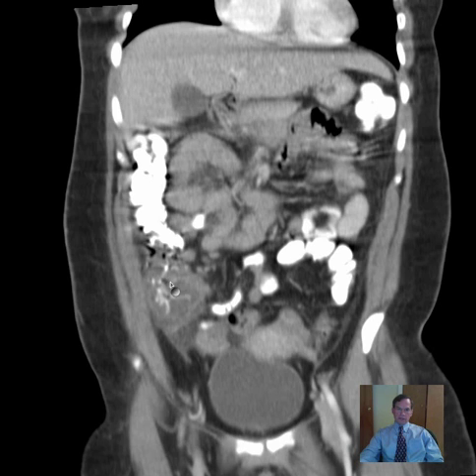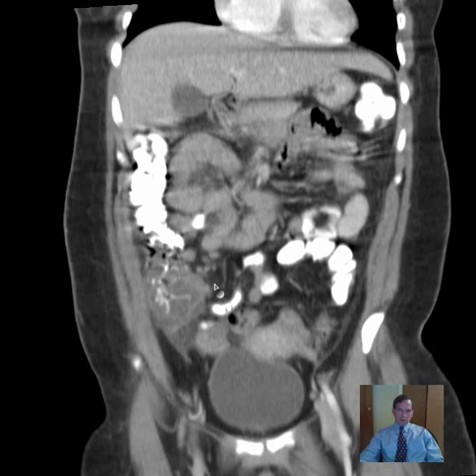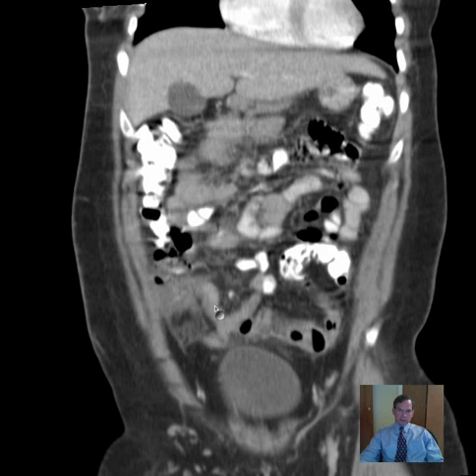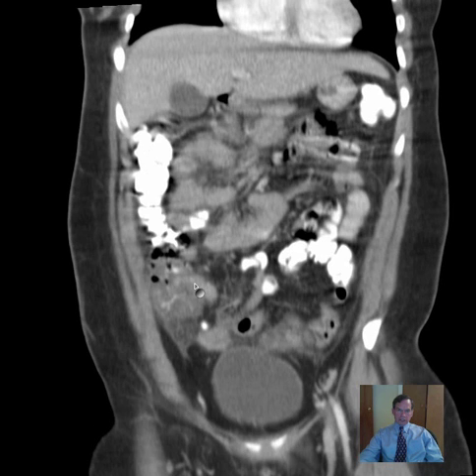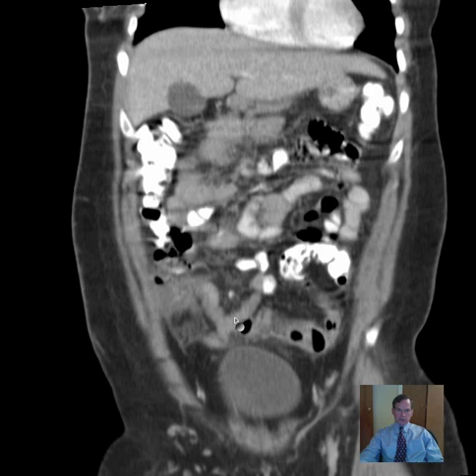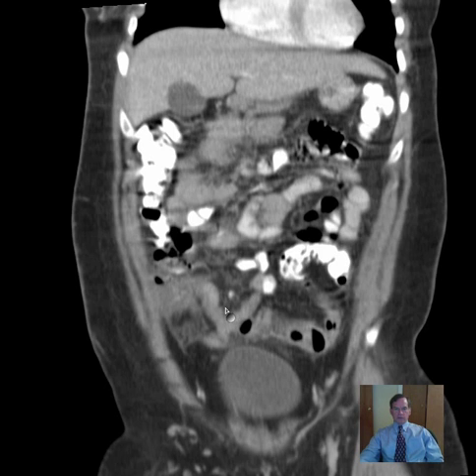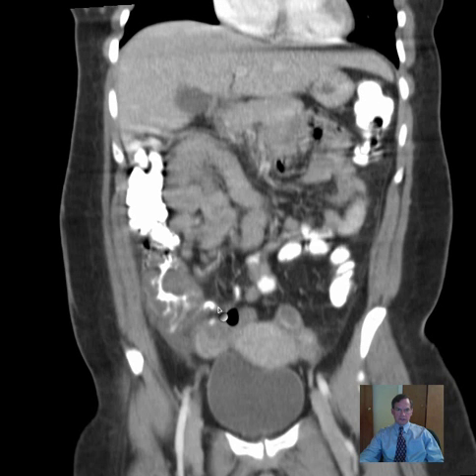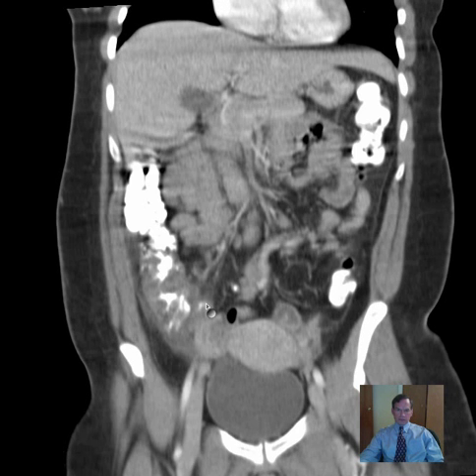This is the ileocecal valve, along with the mucosa of the surrounding cecum and lower right colon. If we look very closely we can see that the terminal ileum is coming into that ileocecal valve region, and that visualized terminal ileum appears normal. So that makes Crohn's disease less likely, not impossible. So we've partly ruled out Crohn's disease. Appendicitis does not appear to be present here.